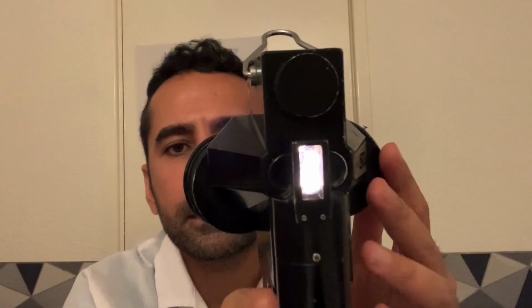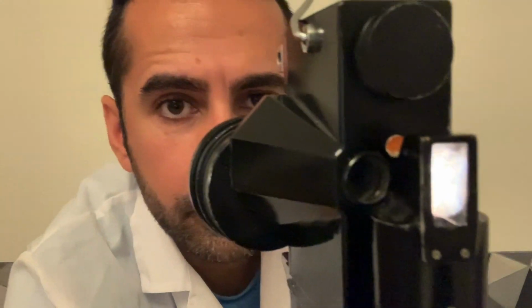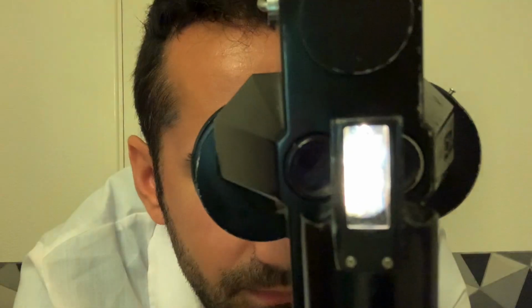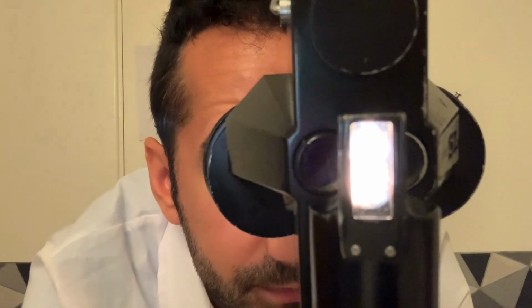Okay, let's check the lenses in your eyes. An external look here, full corneal coverage. Good. Let's just have a look at the fit of the lens now. Okay, looking at my right here again. Okay. Blink. Now looking up. Blink while looking up. Good. Look to the right. Look to the left. Push the lid up here, we'll do a push-up test. Okay, well-centered lens, minimal decentration, good movement on blink and good recovery and easy to move with a push-up test.